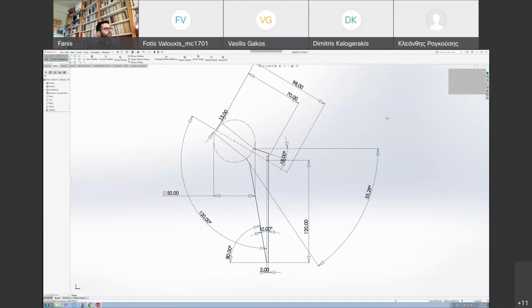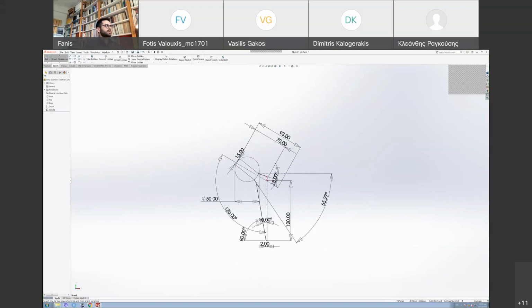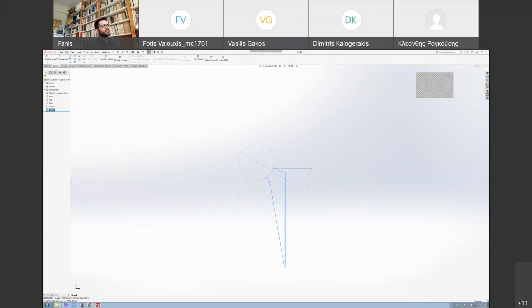Okay, so now we have a fully defined sketch. Don't pay attention to the dimensions. I will provide it to you. It's not exactly a fully parametric design, but you just need to begin with this simple 2D design, and the rest will come up as you work. So, okay, this is the design essentially we're trying to make.